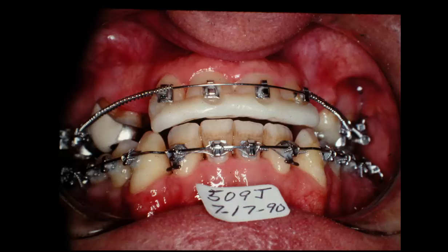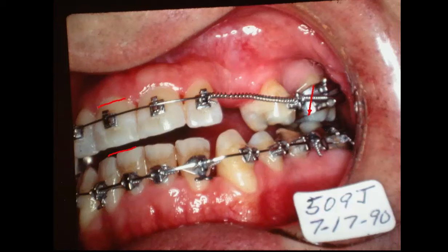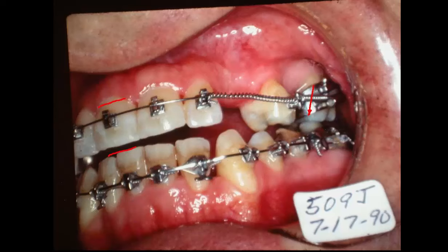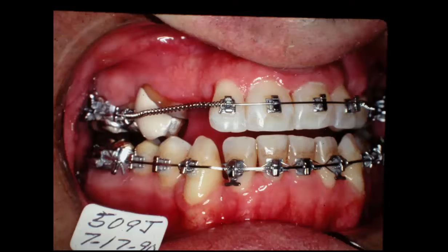Now here we've looked at it again, and it's getting good contact with the bicuspids and molars back in the back. So we take the bonded material off the teeth. You see, we're going to remove this and take it off the teeth now. So we did that. Now you've got a gap in here. You've got about a millimeter clearance in here, but you've got these teeth in contact, and the other side will have contact also. You see, this is contacting.